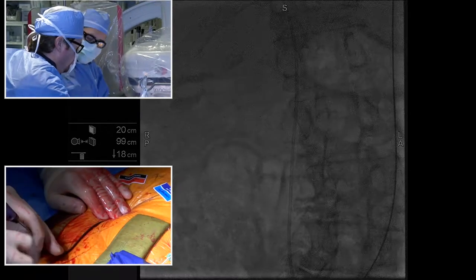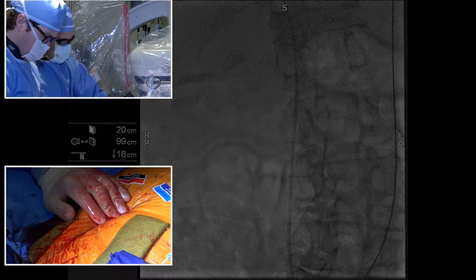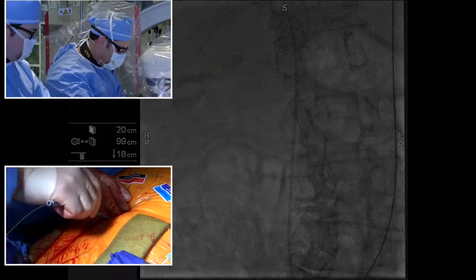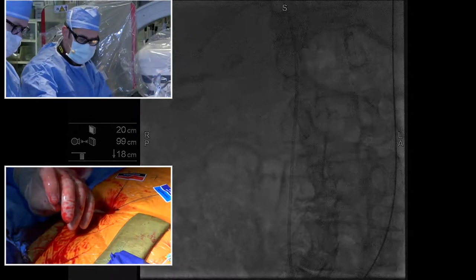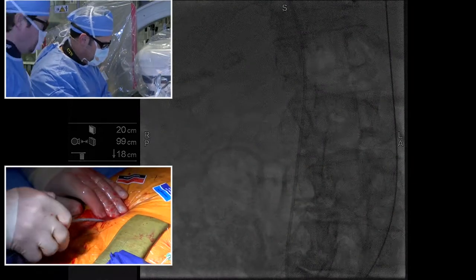And then what we're going to do, Matthew, is give me the small dilator, the gray one right there, and we're going to do the wire swap through that, okay? Okay, so we're going to put a little dilator in here to stretch out the artery a little bit more. Okay, now I'll have the Amplatz, please. So we're going to put our stiffer wire through here, which goes no problem. Okay, so Ray, let's back this out.